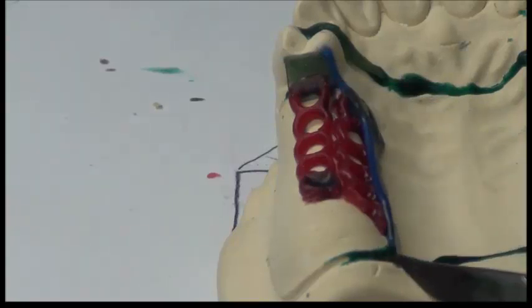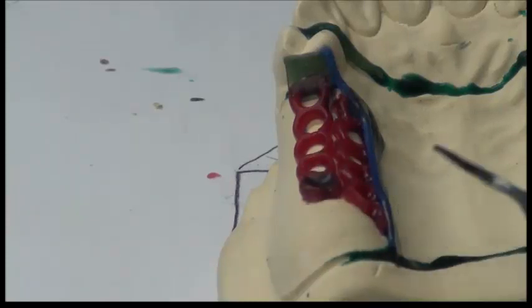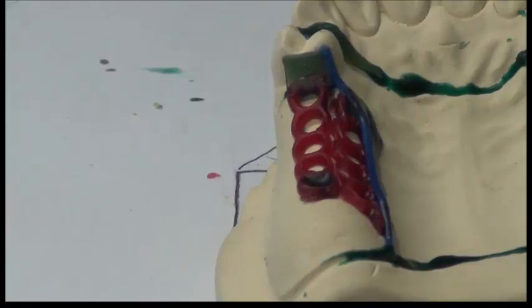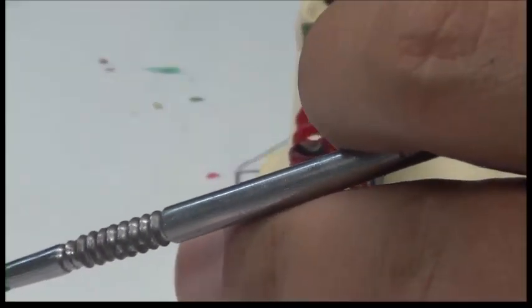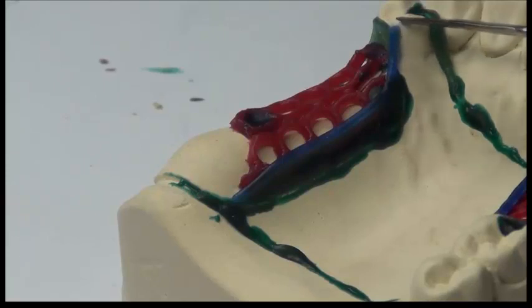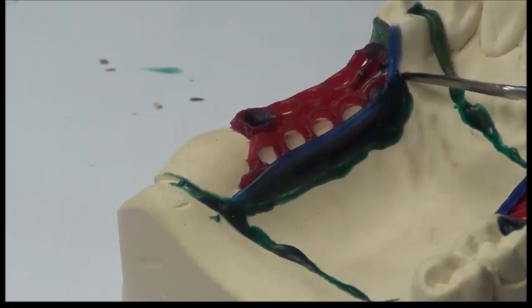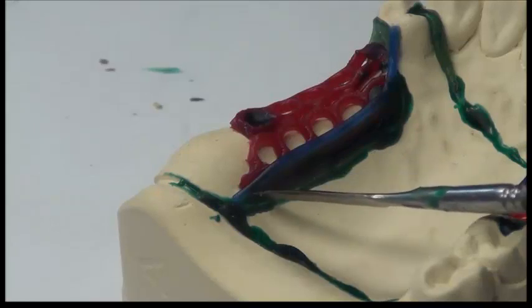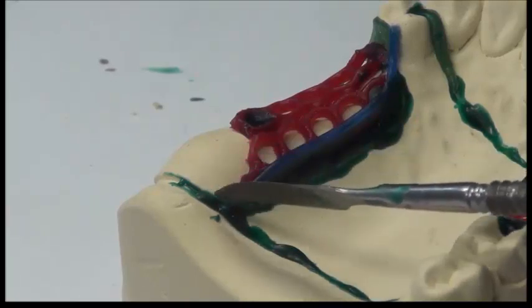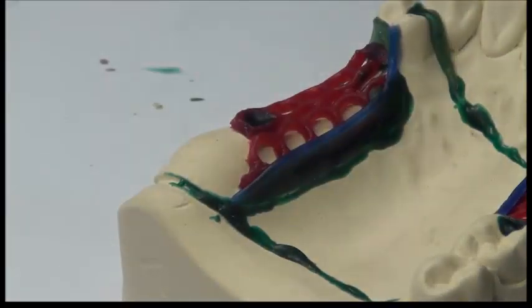Okay? The second question was, do I end my finish line short from the tuberosity? The answer is no. We need to extend the external finish line up to the hamular area. And it should be straight. So this is the free saddle area. So if we're looking at the free saddle area, the external finish line or the step begins, we said, from the proximal plate, the guide plate here, running down vertically, and then it runs horizontally parallel to the ridge, reaching up to the point of the hamular area, because the metal will extend here. The metal palatally extends to the hamular area, but over the ridge and buccally they do not extend. Okay? That was the second question.